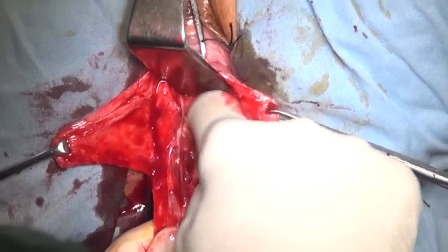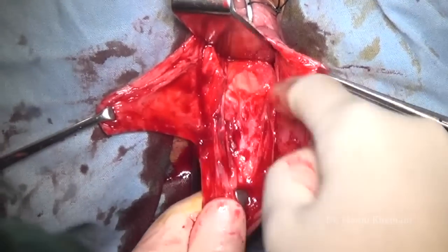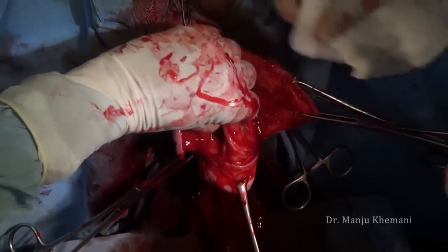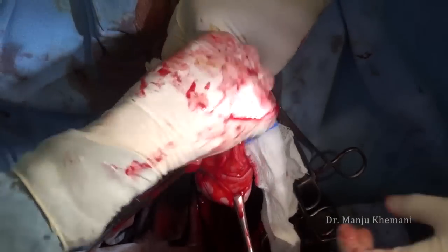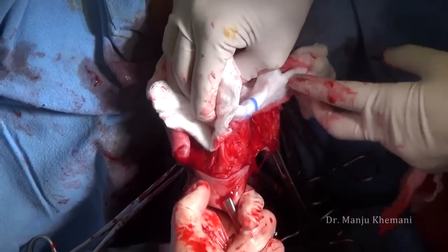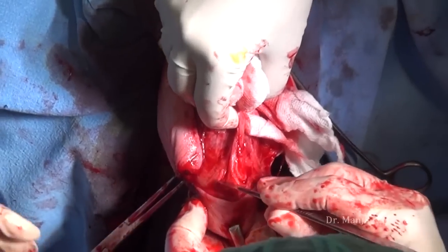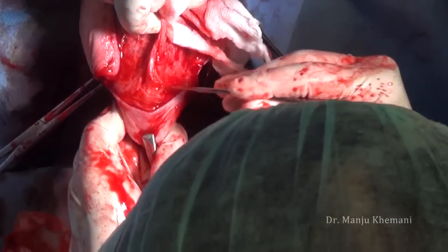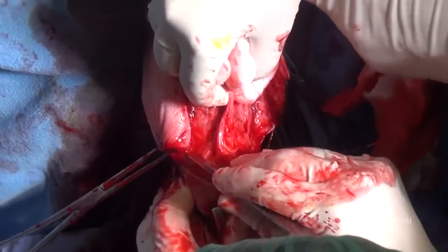Once you have pushed it up you will find the glistening peritoneum, which is then cut. This is a second case where I'm showing you that sometimes, in spite of all precautions, you may get into trouble. But if you are vigilant you'll be able to prevent bladder injury. Here my assistant is holding the bladder up and I'm making an incision to separate the bladder from the vagina.